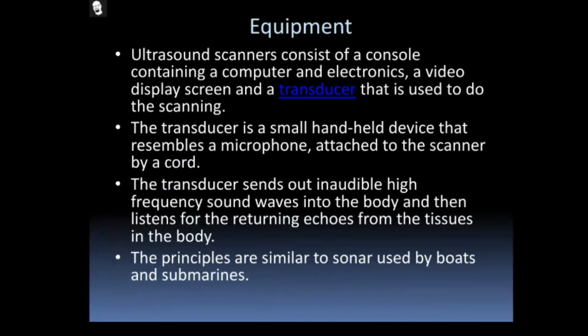And then the equipment. The ultrasound scanner consists of a console containing a computer and electronics, a video display screen, and a transducer that is used to do the scanning. Using the transducer, the video display screen will show what is happening in the internal organs.